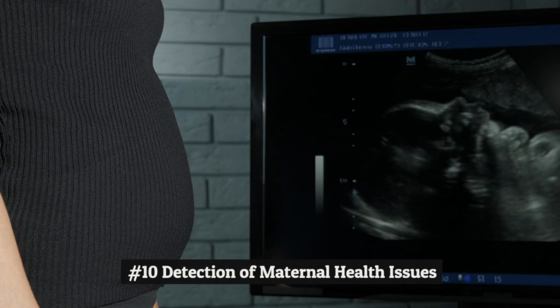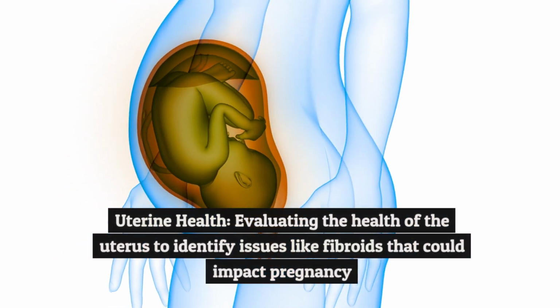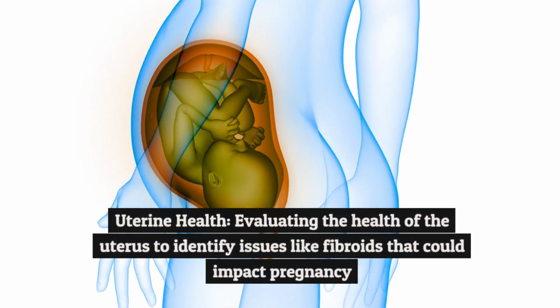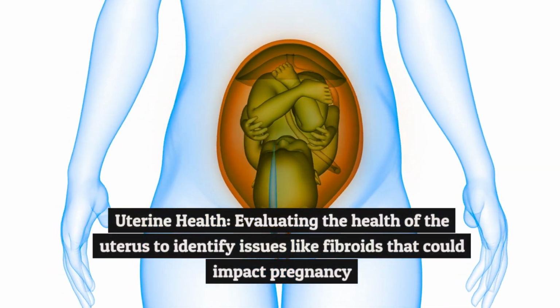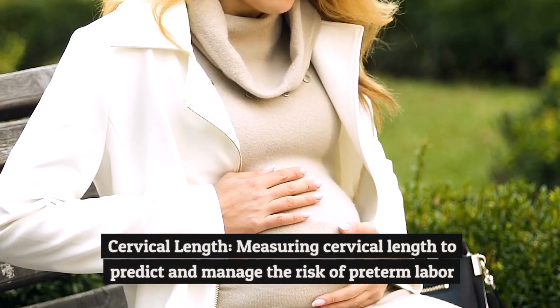Number 10, detection of maternal health issues. Uterine health, evaluating the health of the uterus to identify issues like fibroids that could impact pregnancy. Cervical length, measuring cervical length to predict and manage the risk of preterm labor.